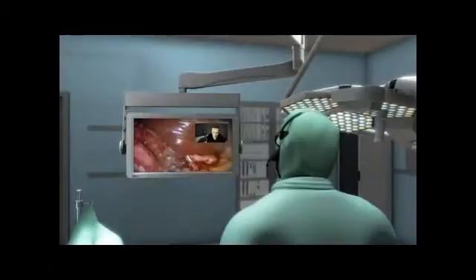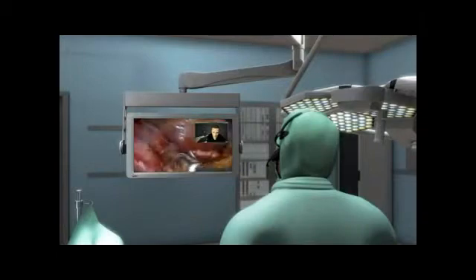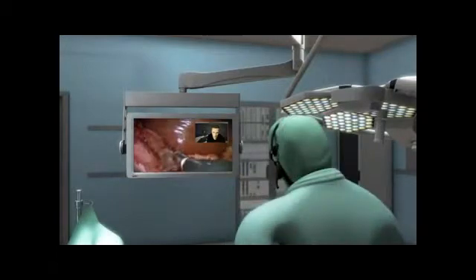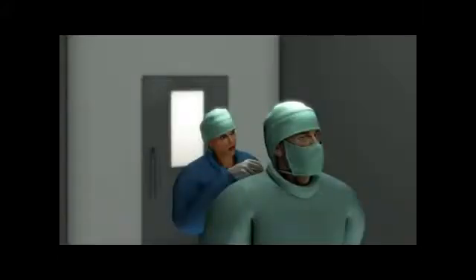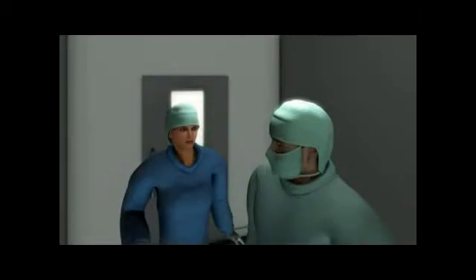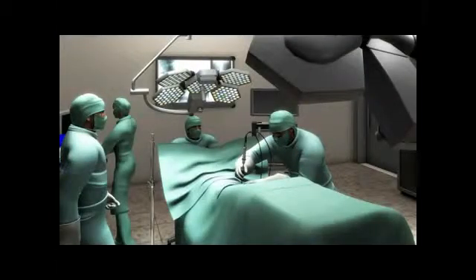On the nearest available computer, the specialist can call up the live video stream from the operation via the network and get a precise view of the situation. After the telephone consultation didn't yield a satisfactory result in the standard operating theatre, the specialist joins the team in person — first going through the hygiene log, then assessing the case.